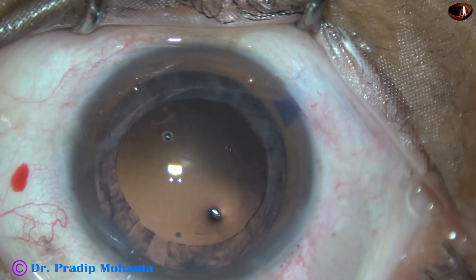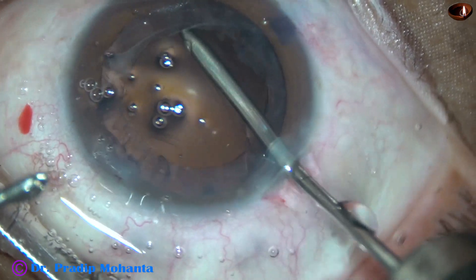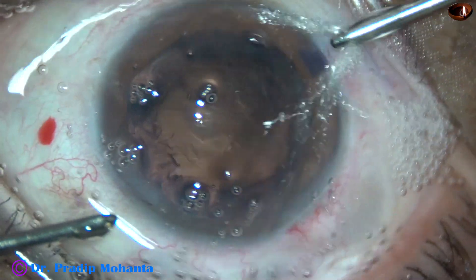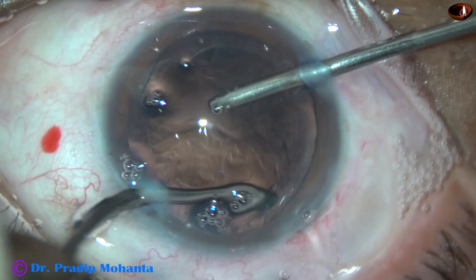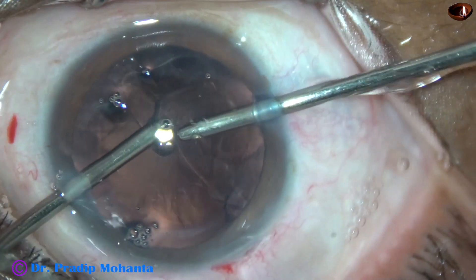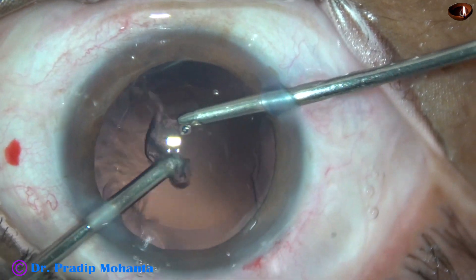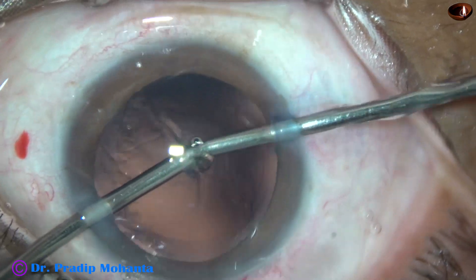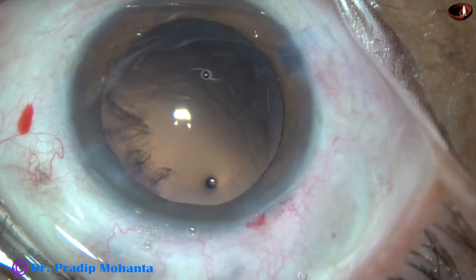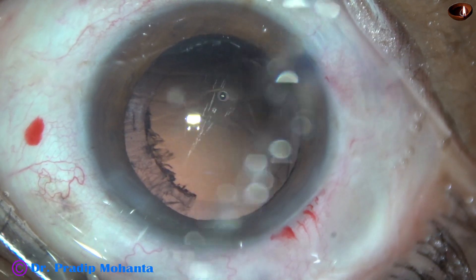And now cortical cleanup. In this case I am going to use bimanual irrigation aspiration. First I irrigate and hydrate the cortex all around. Then I go through the right side port with the irrigation, and the aspiration is through the left side port. I aspirate and feed the cortex through the aspirating port. I had to feed a lot because the vacuum was only 200 mmHg. From now onwards I am going to use higher vacuum — about 300 mmHg vacuum and 30 ml per minute flow rate. See how fast this portion of the cortex is removed.